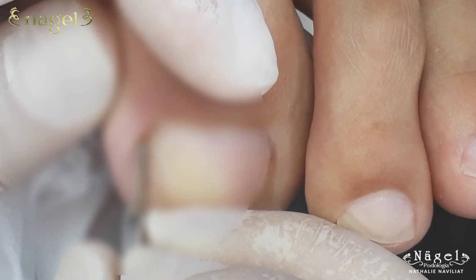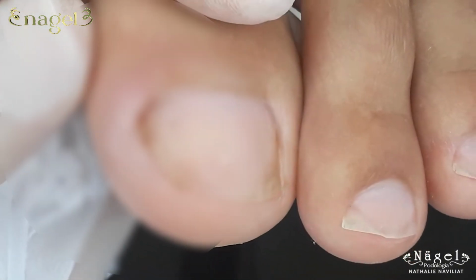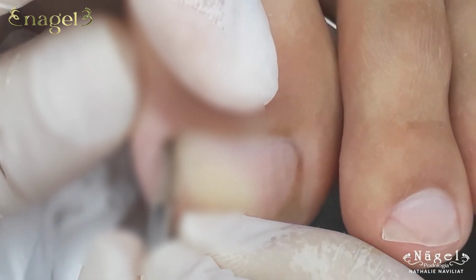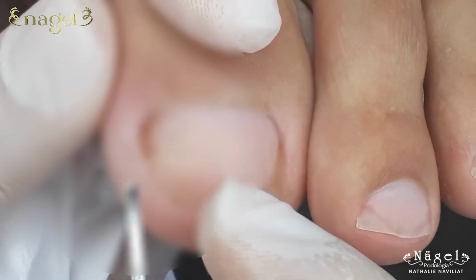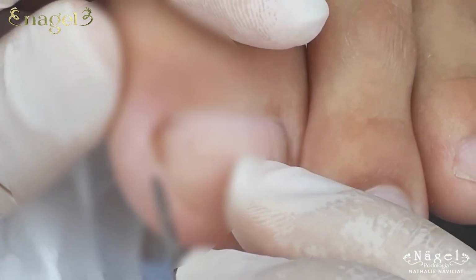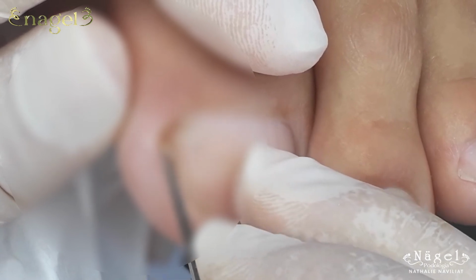This spur was getting pulled, but the improper trimming hid it in there. Using the tweezers, I locate the spur, which is loose in the skin, and remove it precisely, ensuring no bits are left behind. I check the area and am thrilled to see no bleeding or exposed tissue. I trim the nail as straight as possible, despite the pre-existing rounded shape.